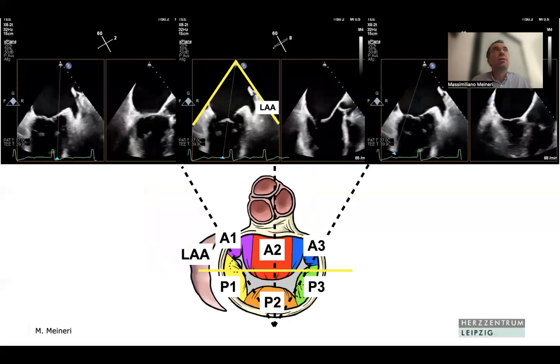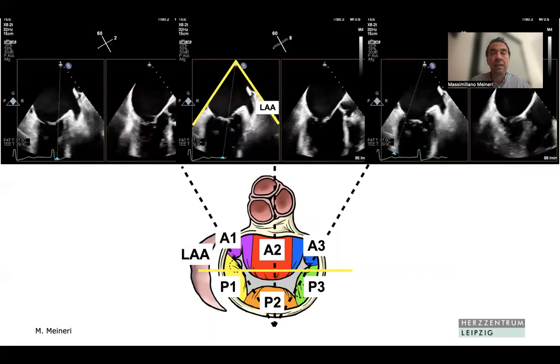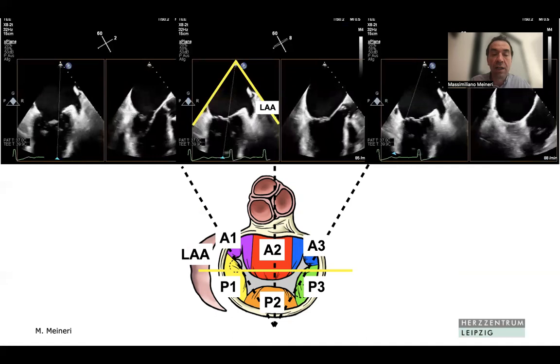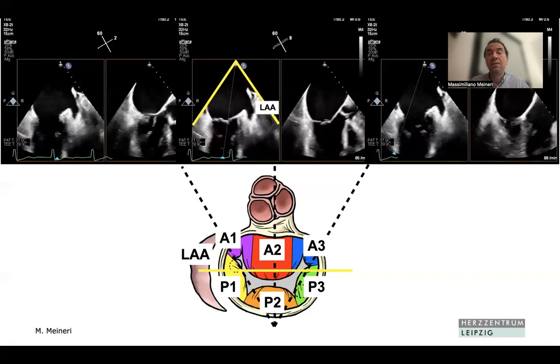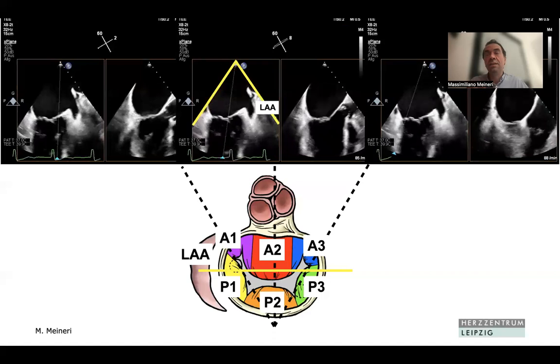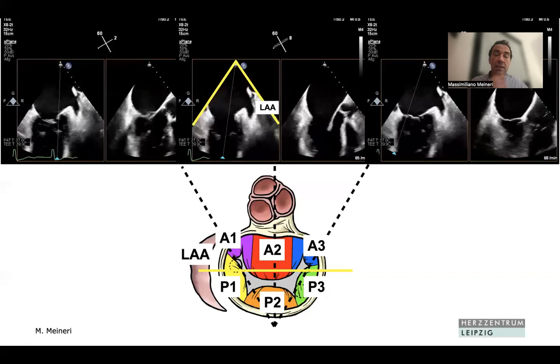We don't have to think too much about this anymore because we can display multiple planes simultaneously. We display the mitral valve in the mitral commissural view — P1 to the right, A2 in the middle, and P3 to the left. Placing the secondary plane in the middle gives us the long-axis view with the two segments. Moving the secondary plane more medially shows the three segments; moving it more laterally shows the one segments.